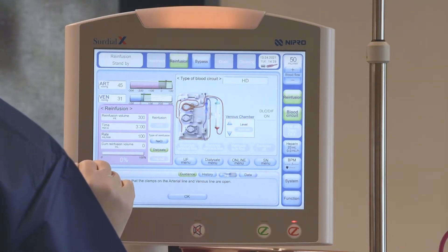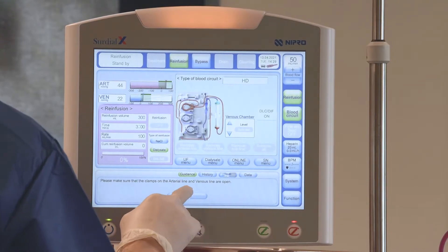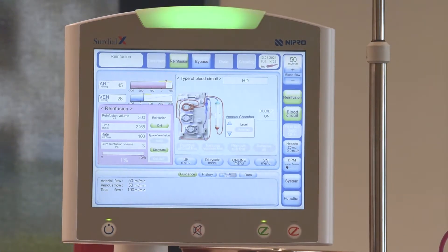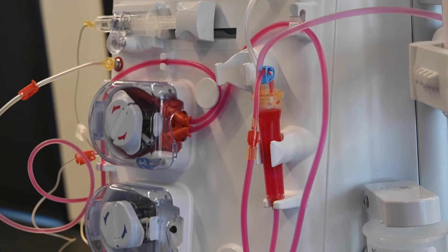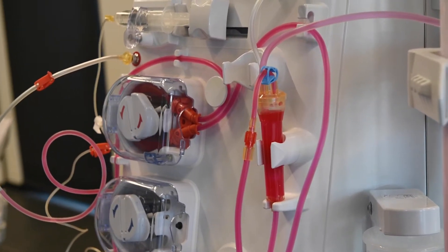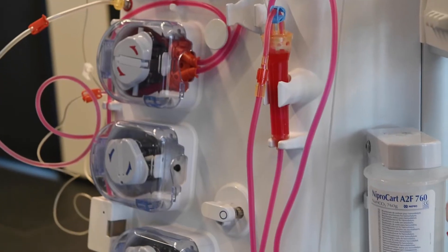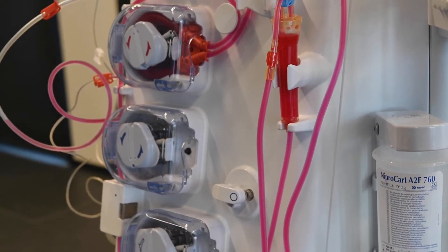Press OK to start re-infusion. The automated re-infusion will start; the guidance box displays the actual re-infusion speed. A combination of 50 ml delivered by the blood pump and 50 ml delivered from the dialyser directly to the venous chamber. The number on the top right of the screen only displays the speed of the arterial pump.